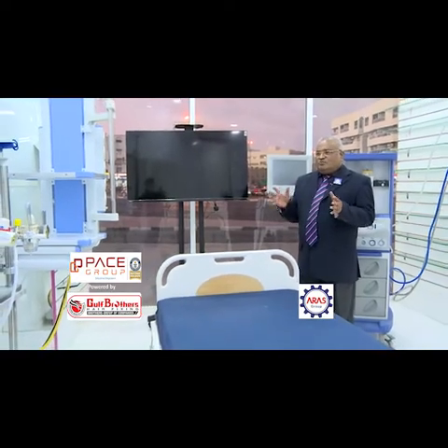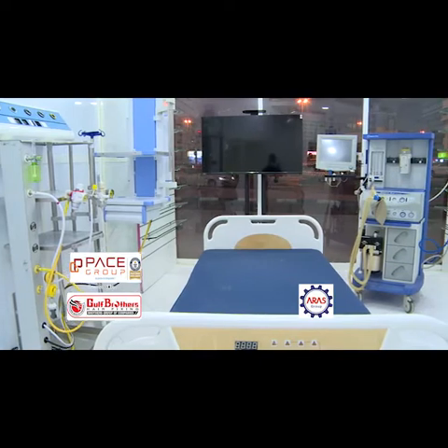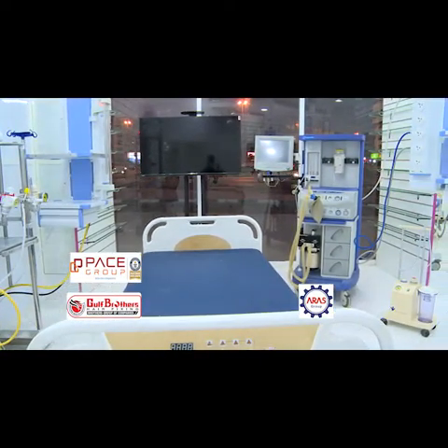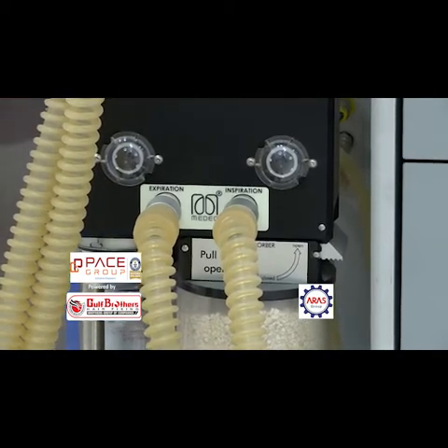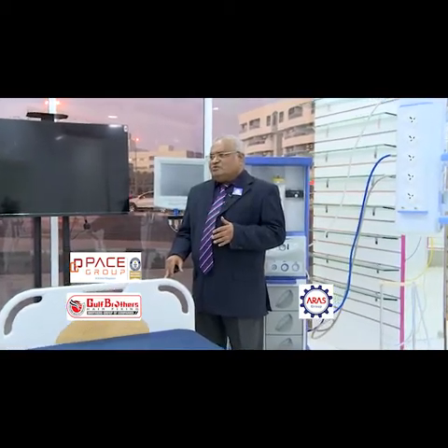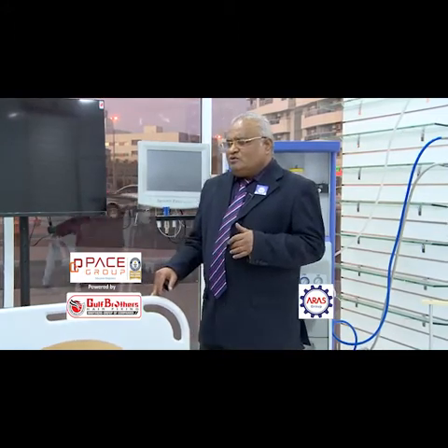When you are talking about the operation theatre, most of the gases are required, because each gas has its own requirement. Oxygen is for life saving. You should always have oxygen, because in the body you have to maintain 98% or 99% oxygen. That is called SpO2. That should always be checked, whether oxygen in the body is there or not.